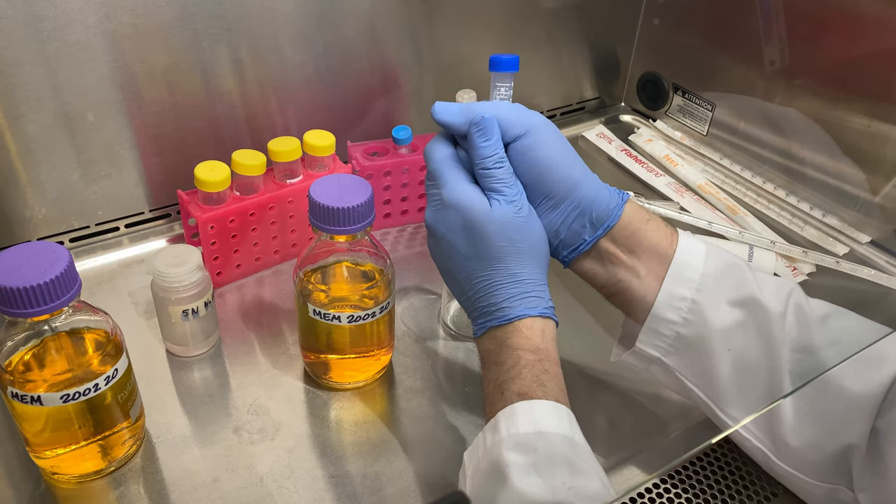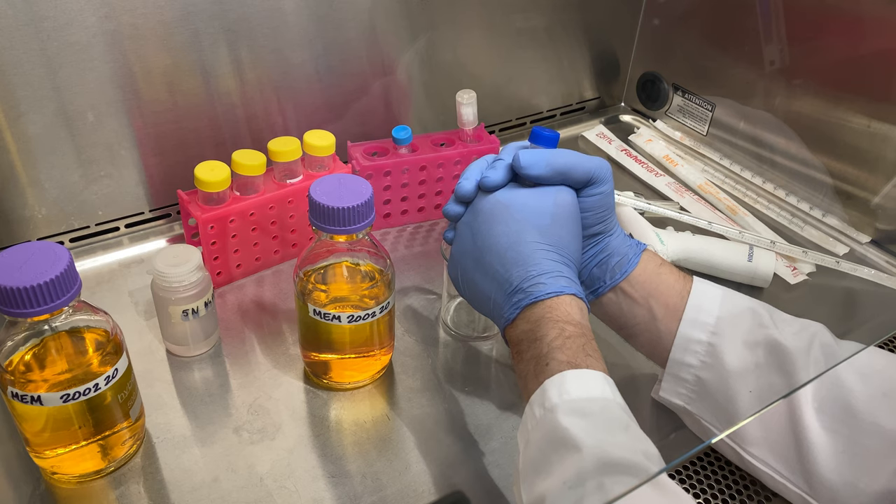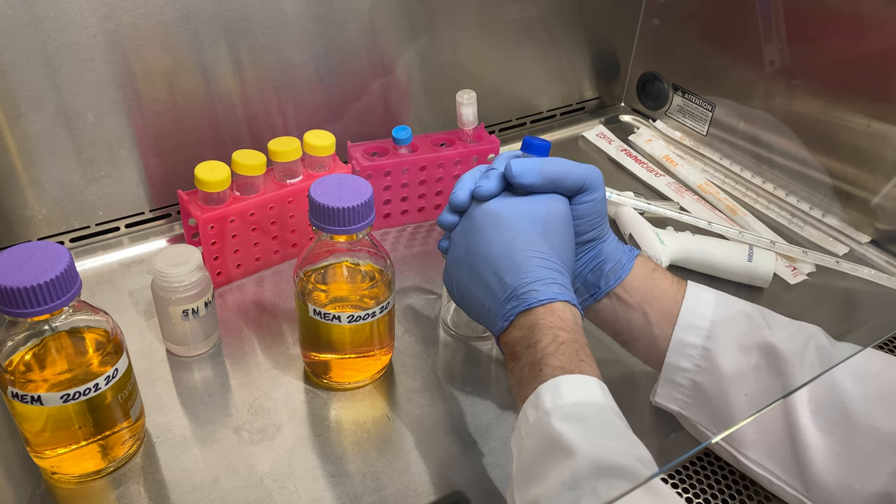When you thaw it out, it will go from a milky to a clear solution. I'm going to use the heat from my hand to warm it up. It will take some time — be patient.